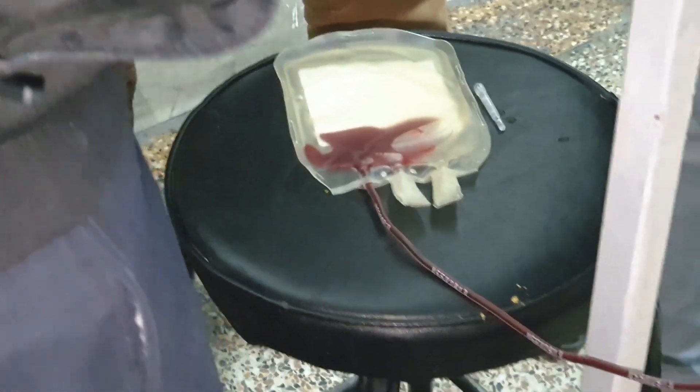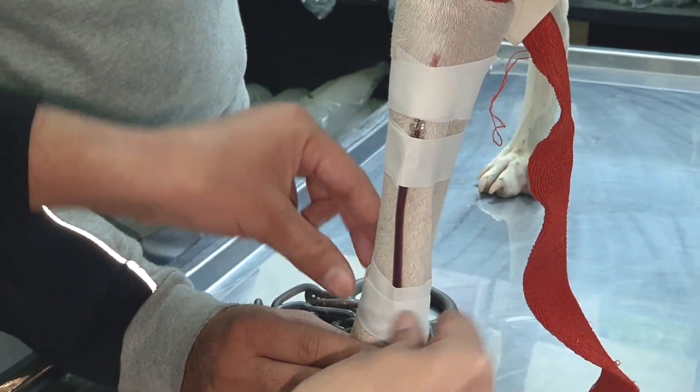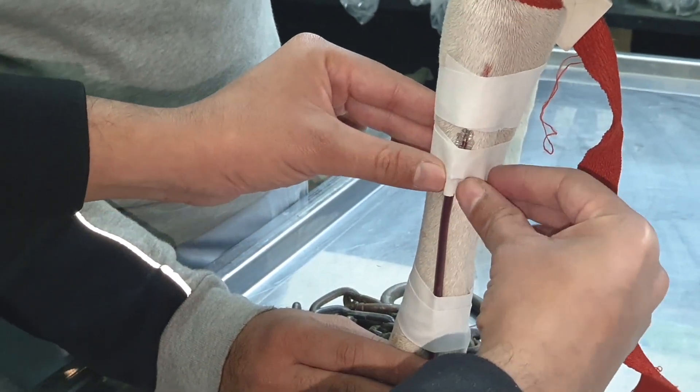We inject a small amount of blood into the recipient and wait at least 10 to 15 minutes for any adverse reaction. If there is an anaphylactic shock, we stop the blood administration and administer adrenaline and other medications.